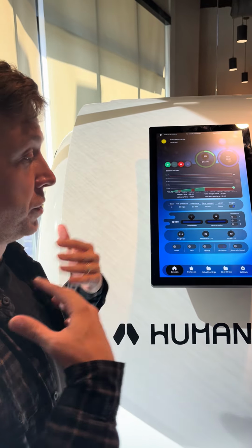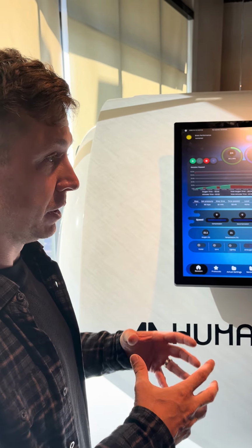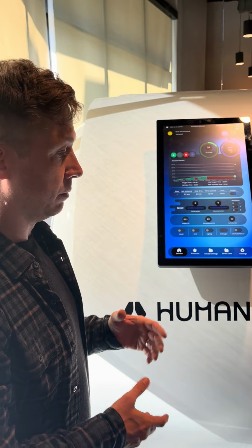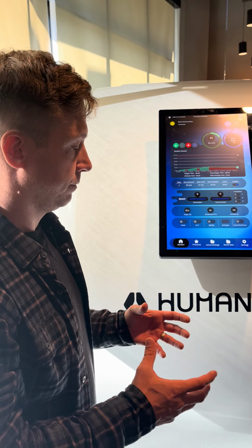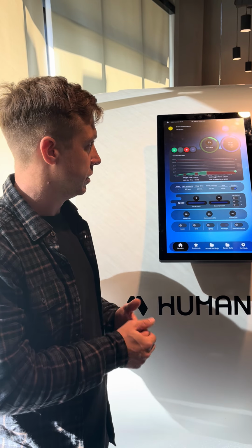And then it can also obstruct their airway, which isn't good on decompression. So, a plastic bottle of water. On decompression, it is going to build pressure, so you want to have them release the top periodically. Metal water bottles can bend and change shapes. You want to keep it plastic, kind of like a vented water bottle situation.